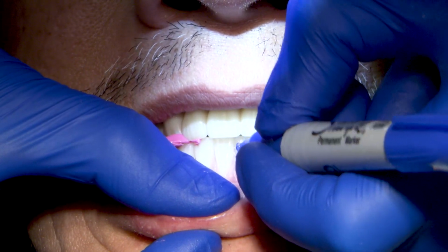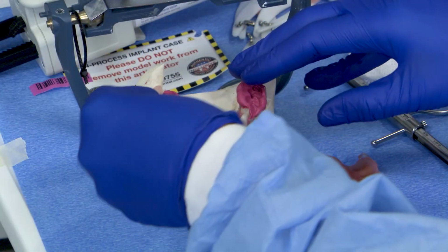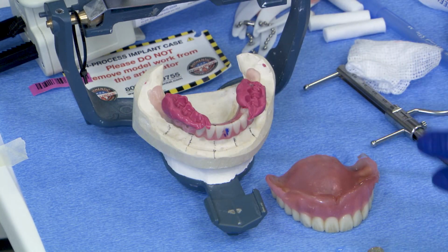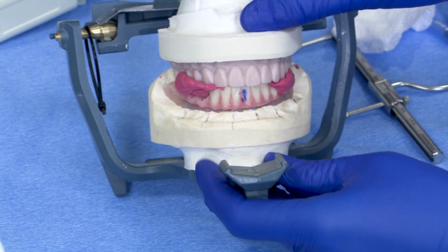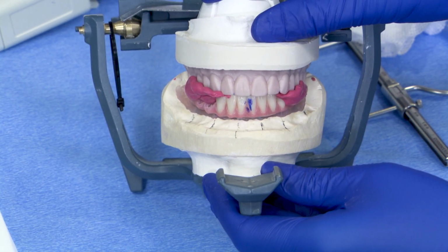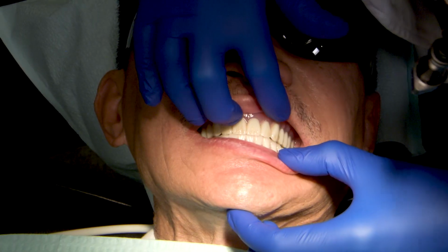Once removed from the mouth, I will go ahead and verify the bite is stable by screwing the wax setup back on the working cast together with the new bite registration and the opposing model. Notice the model is no longer attached to the articulator. From here, it is important to ask the lab to remount the lower model with the new bite registration.